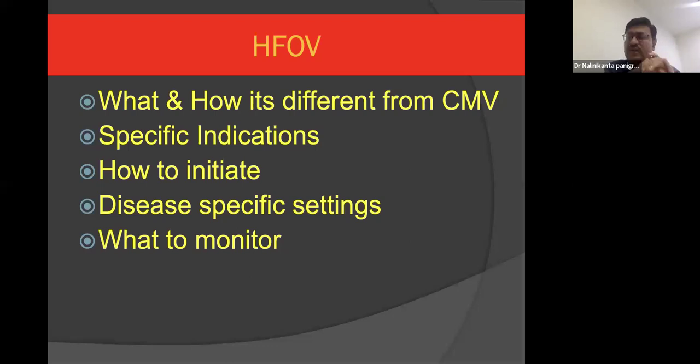If you are using HFO, the success lies in the monitoring. Unless we are carefully present at the bedside, monitoring the ventilator parameters and the vital parameters of the baby, we won't get optimal results. The key to success of HFO is constant, vigilant monitoring and responding to physiological and other parameter changes in the baby during ventilation.